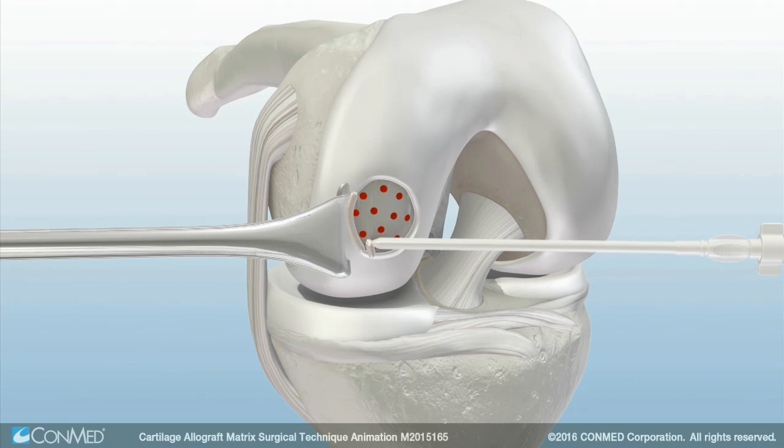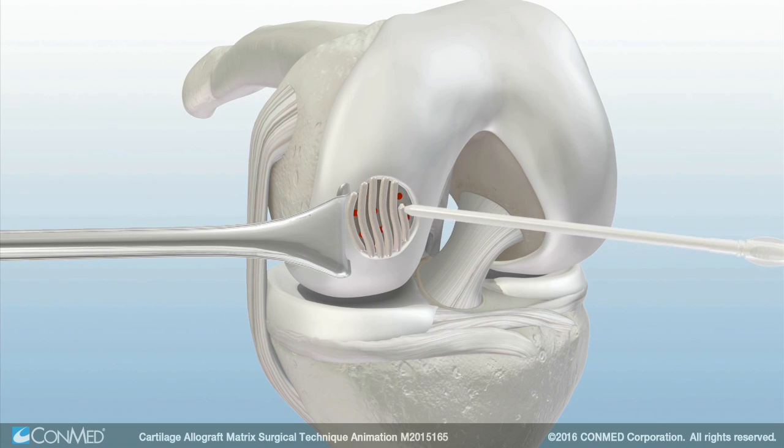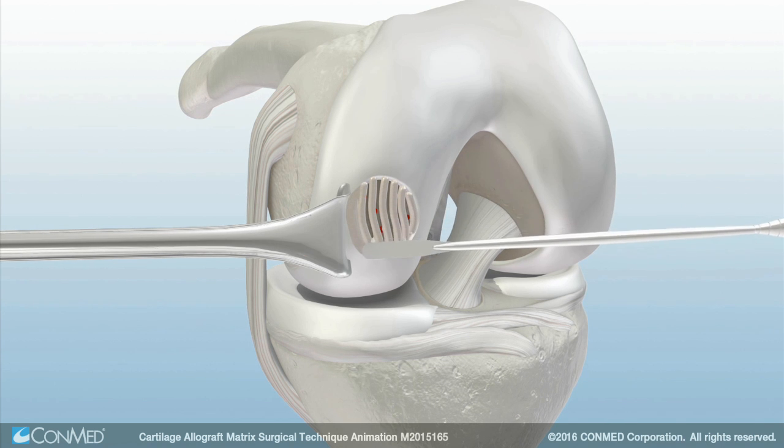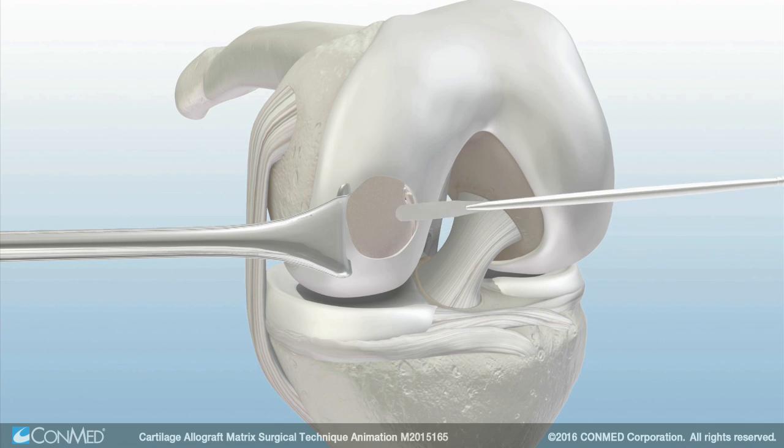To apply the mixed cartilage allograft matrix to the defect, use a syringe and delivery cannula. Then smooth out the cartilage allograft matrix and remove any excess with a metal spatula. Ensure the cartilage allograft matrix is not proud beyond the walls of the defect.